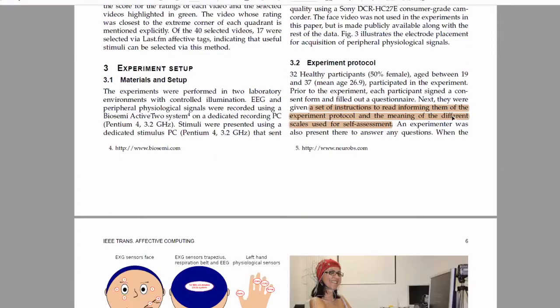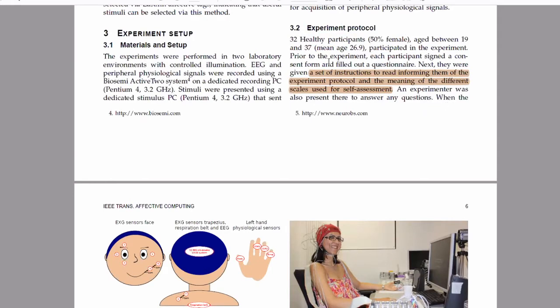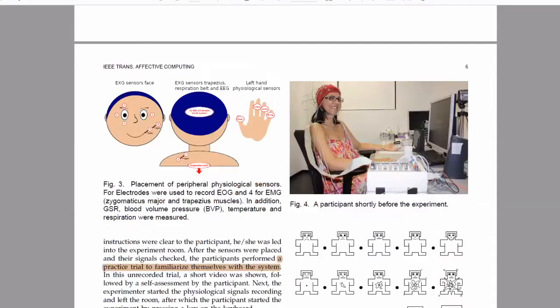The experiment protocol is also important. This will save you a lot of time if you're planning to do one of your own little experiments in the future, or even in this project at stage 3. What they do is they ask the participants to first read a set of instructions, and they also explain the experiment procedure to the participants before the experiment even starts.